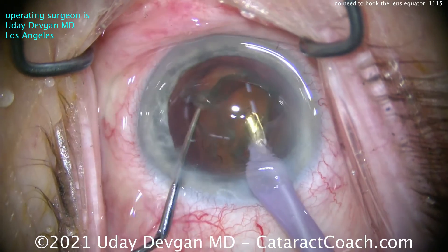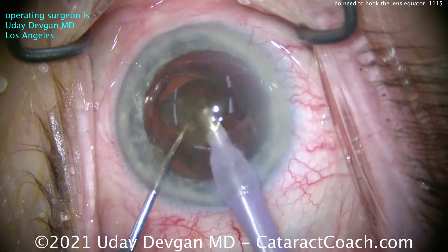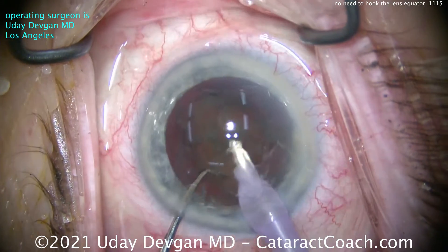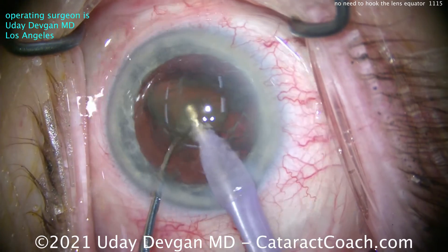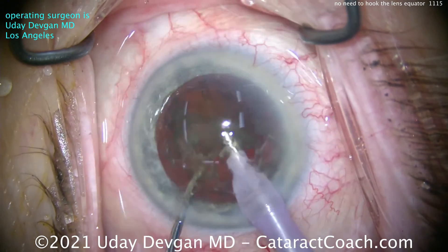At the end we can bring it up — this is more of the horizontal technique going around the lens equator. But that initial chop and the subsequent first quadrant chop were done by just placing the chopper into the nucleus within the capsulorrhexis. No need to go under the rhexis edge.